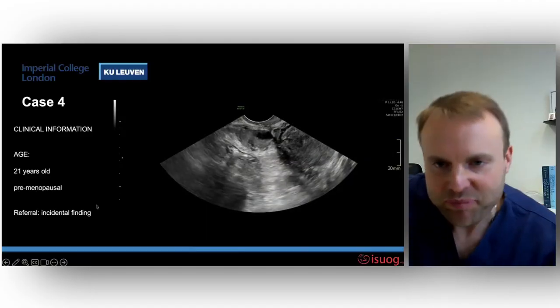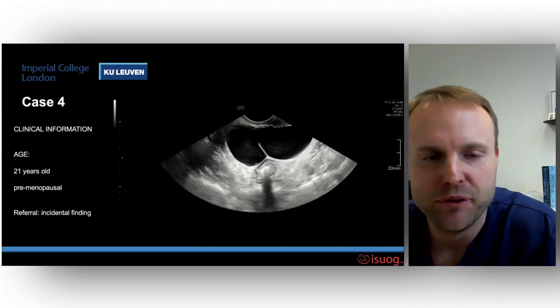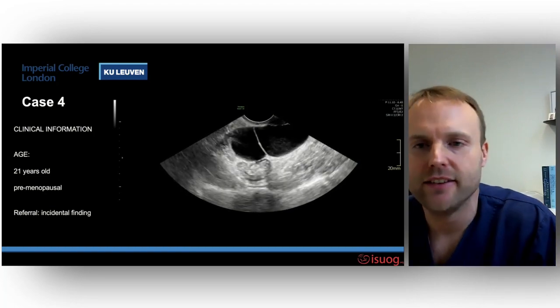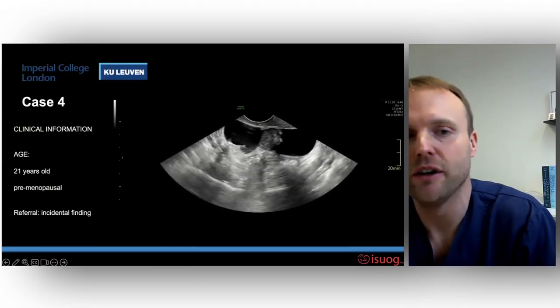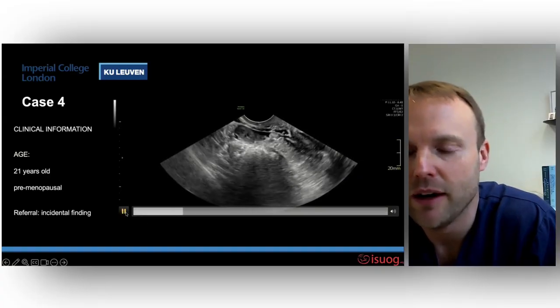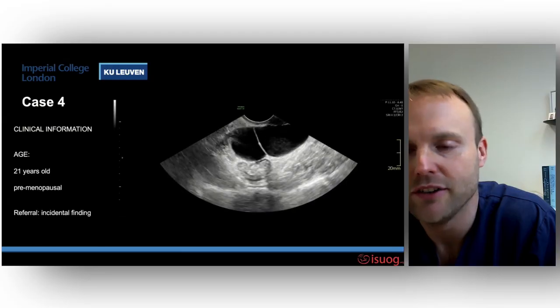Thank you, Nina. It's a pleasure to be back. I will have 2 cases left to discuss with you. The 4th case is a 21-year-old woman. She's premenopausal, and it was an incidental finding of a cyst. You can see here at the start of the clip the ovary, the normal part of the ovary, so the normal ovarian crescent sign.